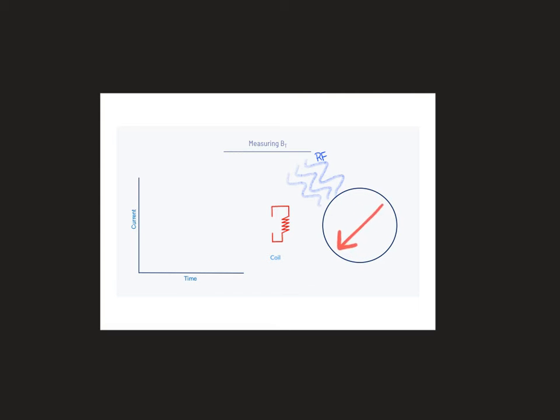So how this is measured is via this coil. When the arrow points towards the coil, it means that the protons are in that direction and the current is high. But right here, for example, it's far, and this graph is over time, so this right here is low, and then the closer the arrow gets to the coil, the higher it gets, and then the further it gets, the lower it goes. Excuse my drawings. And then it gets further, and then it gets closer.